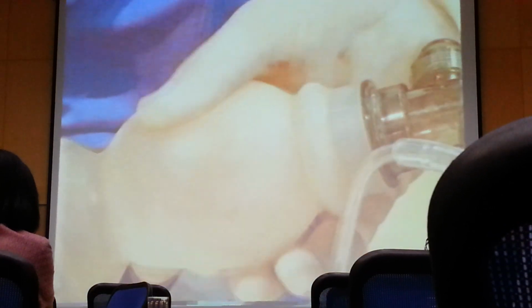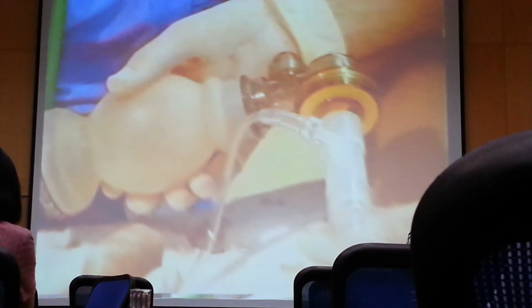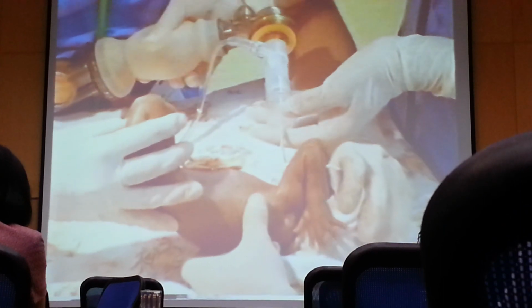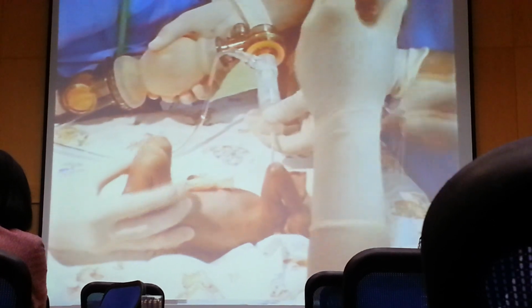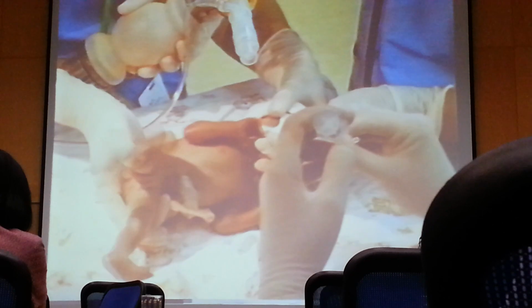Manually ventilate for 30 seconds. The bag should be capable of delivering 100% oxygen. Ventilate to prevent cyanosis and to provide adequate air exchange and chest wall excursion. Next, rotate the infant on the cephalocaudal axis so that the head and upper shoulder are slightly down.